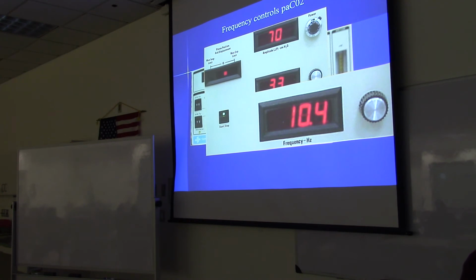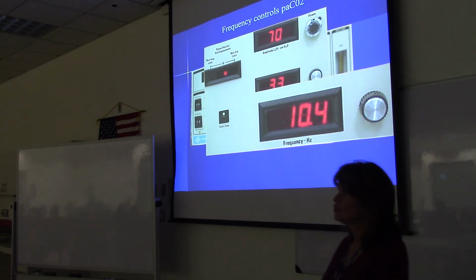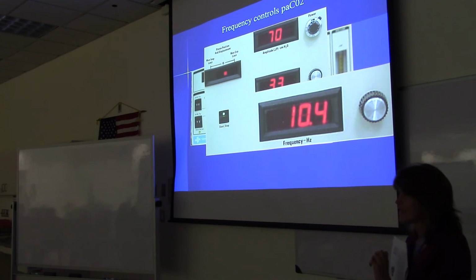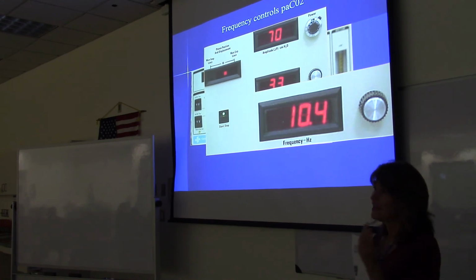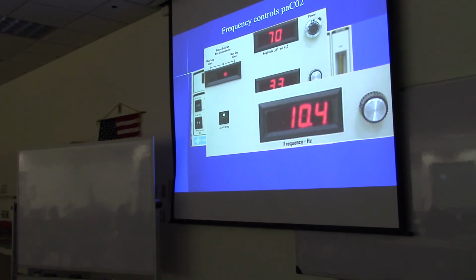All right, so if you get a blood gas and the CO2 is high and you want to get rid of some CO2, I told you one thing you could do already. What was that? Lower the Hertz. Okay, yeah, and that's the second thing. So I already mentioned the amplitude. You can go up on your amplitude, and that'll get rid of some CO2. And then the other thing would be to lower Hertz. So go up on amplitude and lower Hertz.